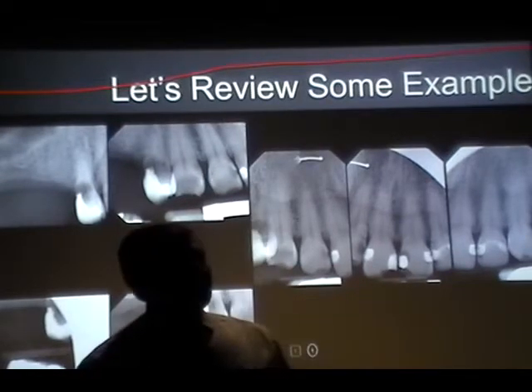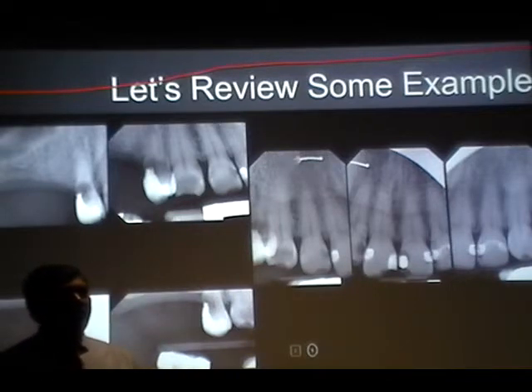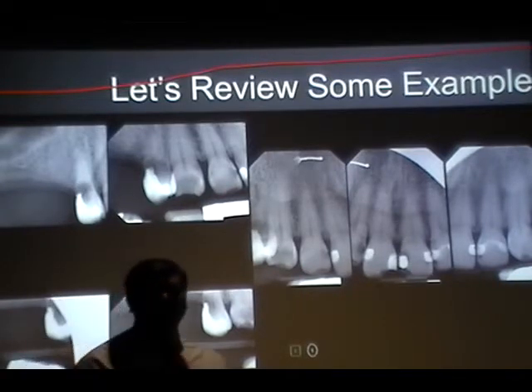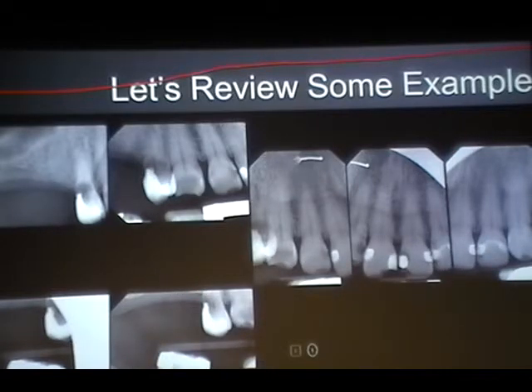Premolar and a... Anybody who's got a laser pointer? Maybe you should bring a laser so that when I ask, you can just point. Yeah. I was going to say it's 5 and 6 that have lack of contact, but the big problem is that he's missing the apex, and the patient didn't bite down all the way on the tab. You can tell because the bar is not even touching the teeth. Okay. Good. How about this one?